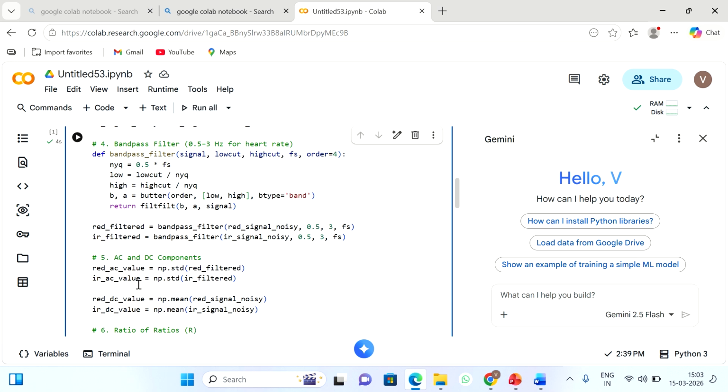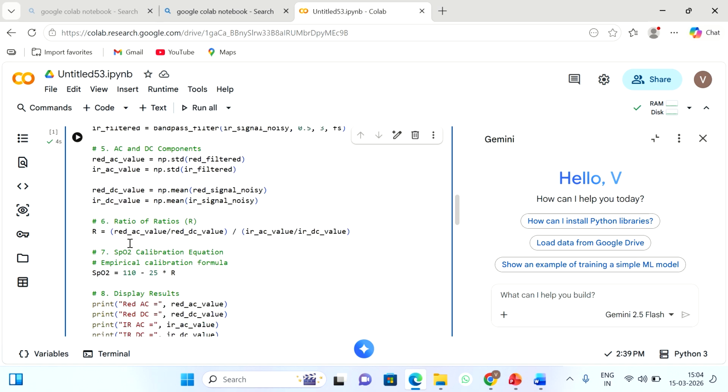So now how to determine the AC and DC components? The AC value is equal to the standard deviation of the red filtered signal. In the same way, the IR AC value is the standard deviation of IR underscore filtered. The DC value, we know, is the mean. Standard deviation means variation around the positive peak and negative peak, but the mean value is the standard reference line only. So red underscore DC value is equal to np.mean of red underscore signal underscore noisy. In the same way, infrared DC underscore value is equal to np.mean of IR underscore signal underscore noisy.